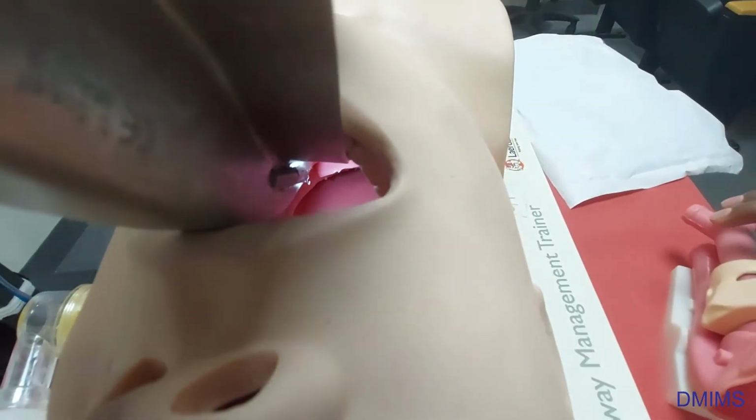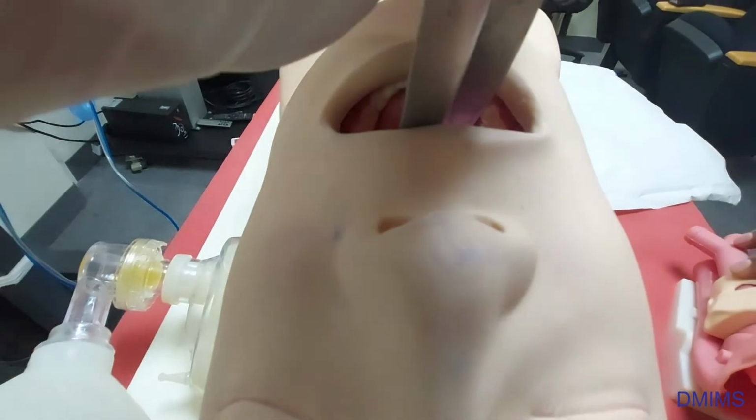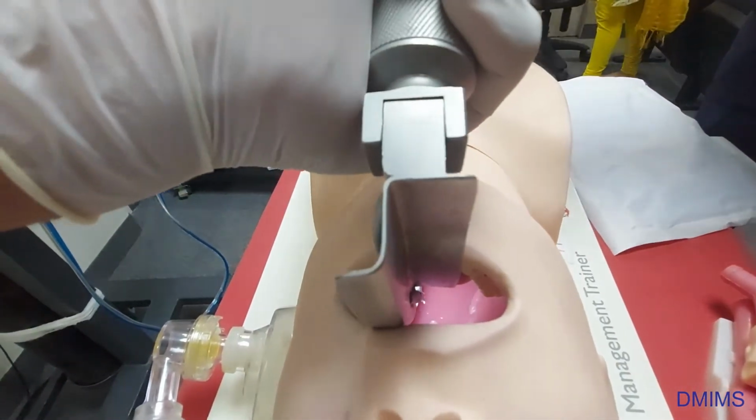You can see the epiglottis here, and then the cords. Now we can see the vocal cords. But here I think there will be difficulty in passing the tube, so we will use the bougie. In this condition we have to use the bougie. Otherwise I can try once; if it goes in, it's okay. As you can see, I am trying to go through the cords, but there is some difficulty. I am not able to advance through the cords. This is a common problem.